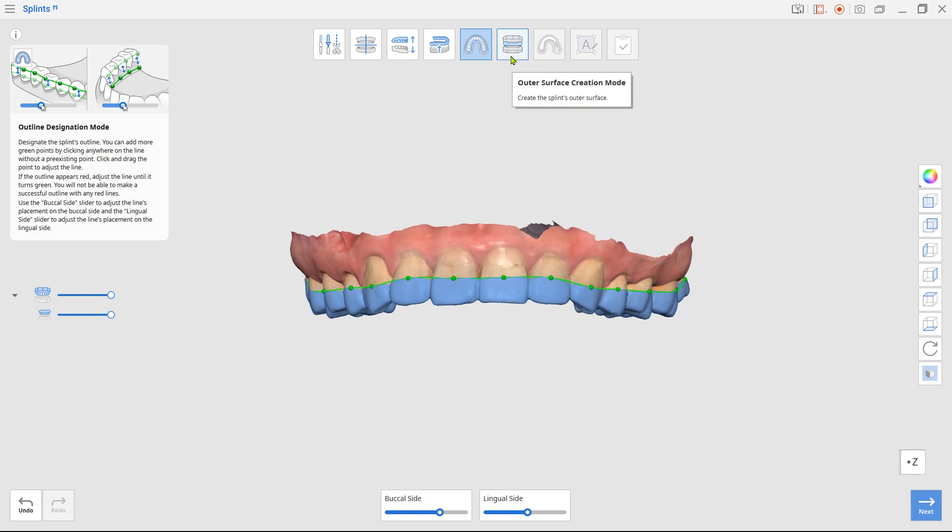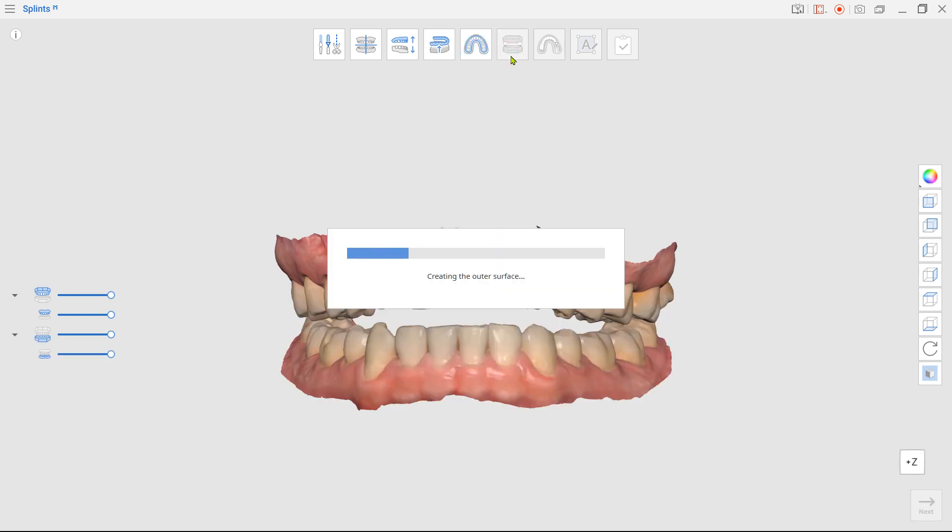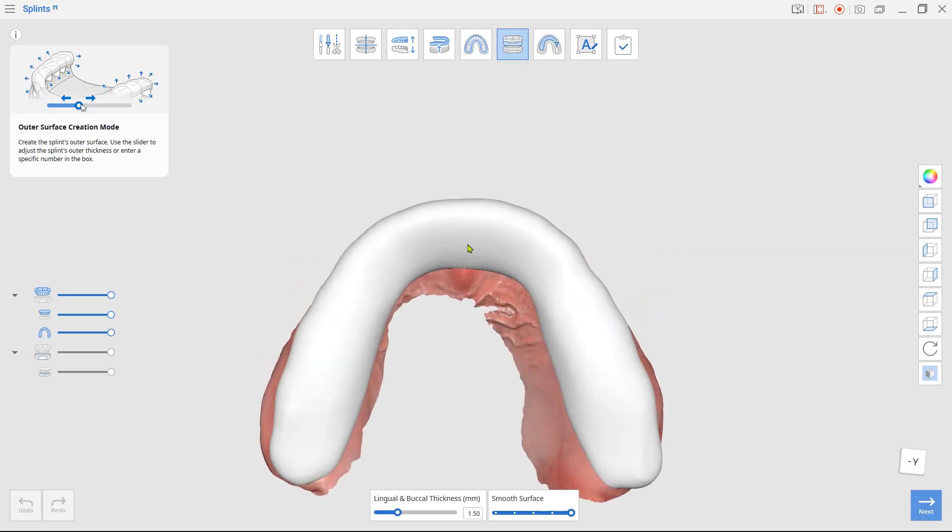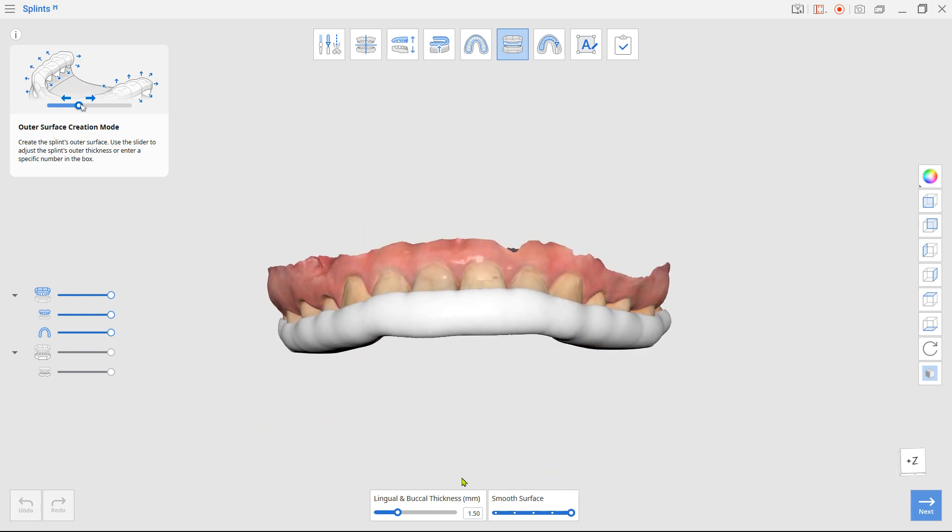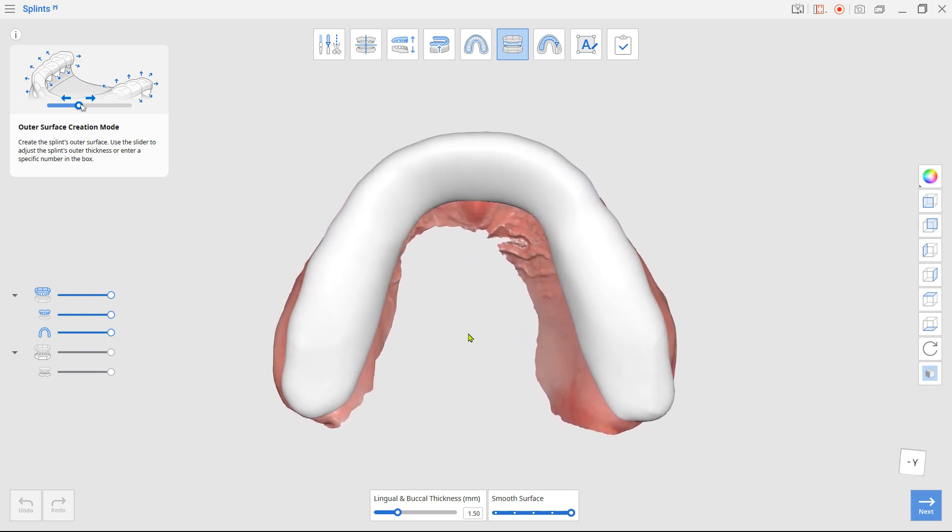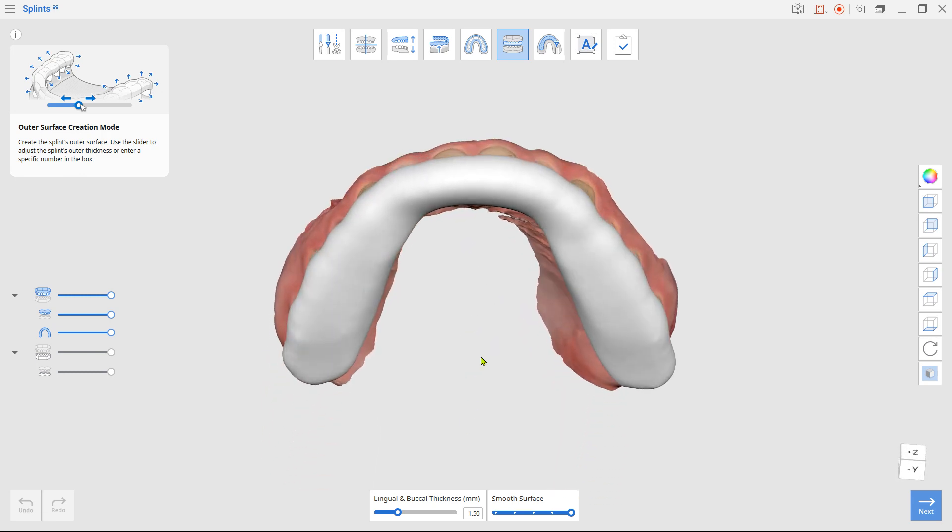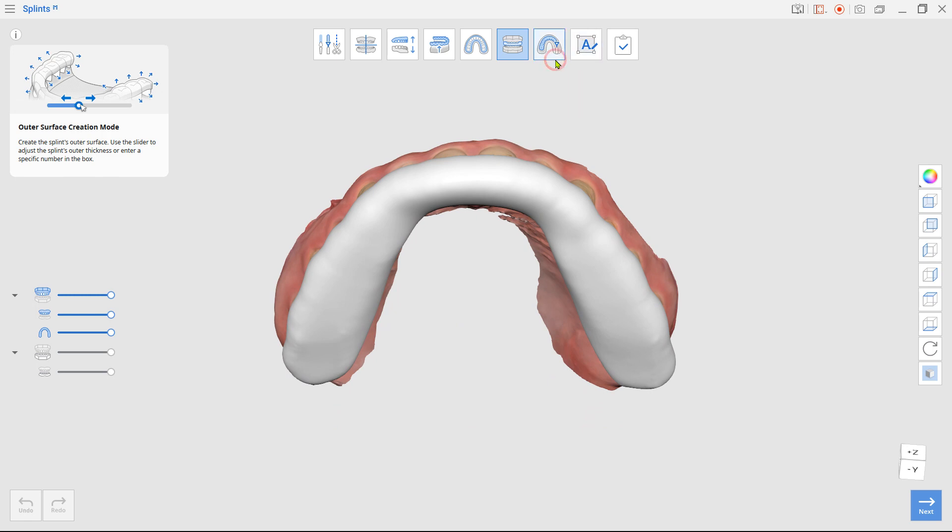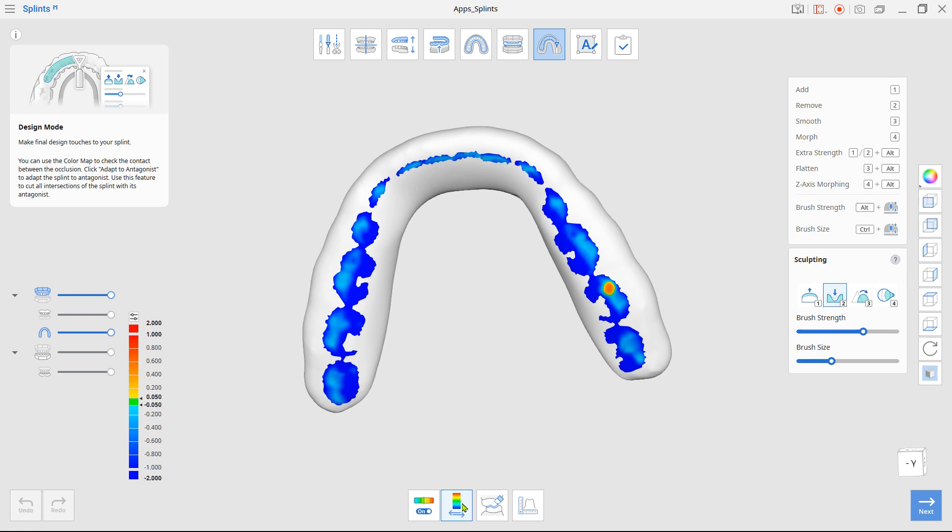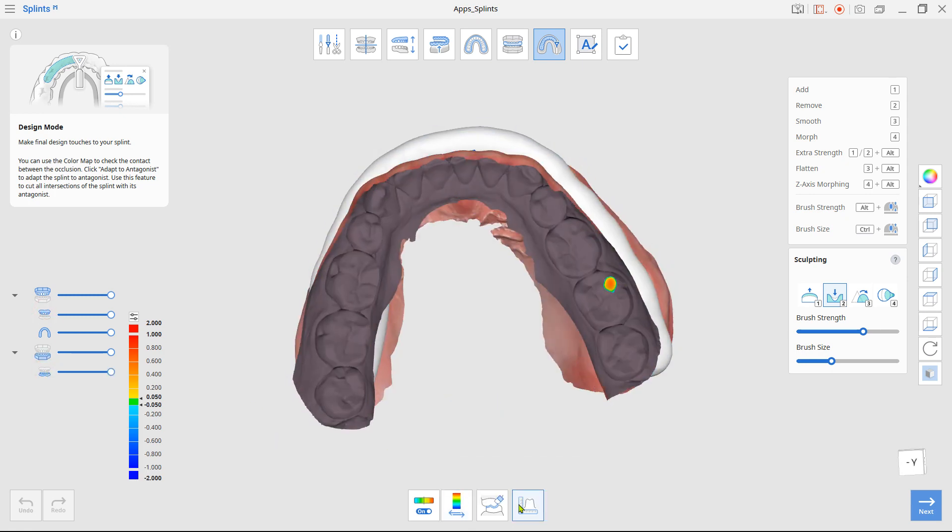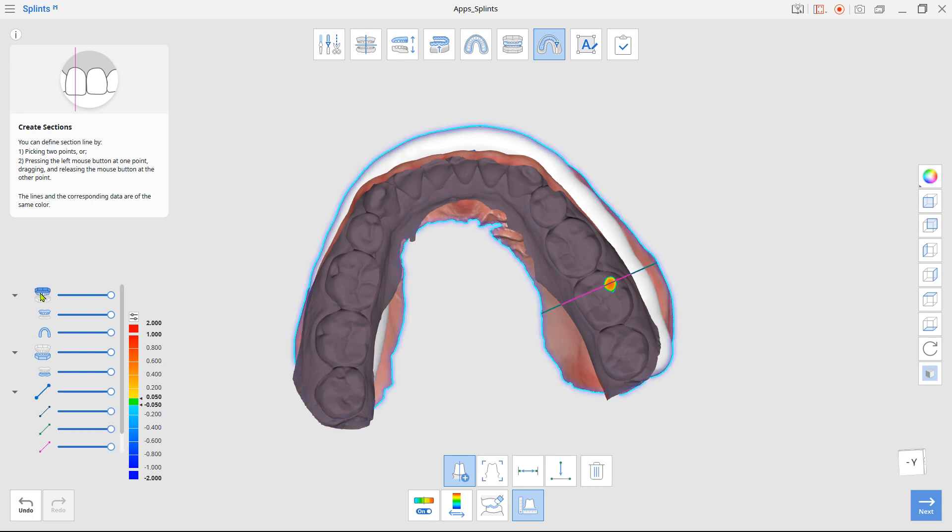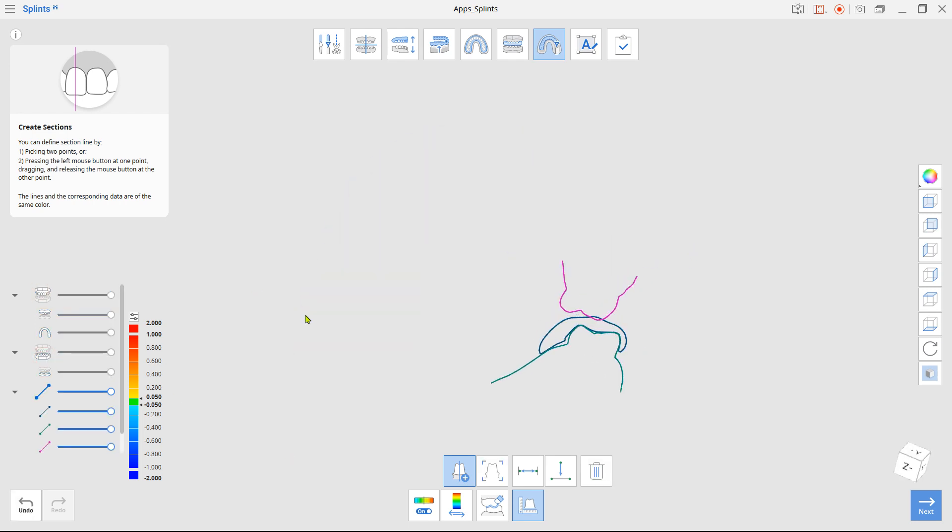And in the next step, the outer surface will be created automatically. The final step is the design mode. Click the deviation display. And if there is a touching area, you can measure the thinness with measurement tools to see if it has enough thickness to remove.